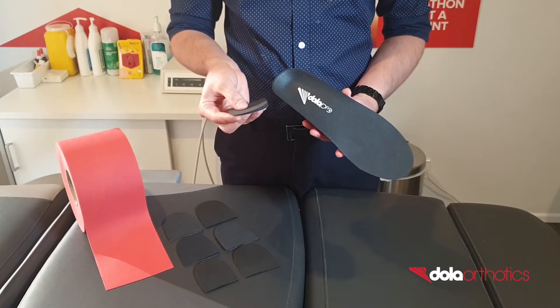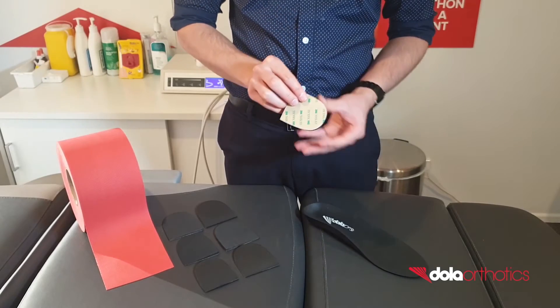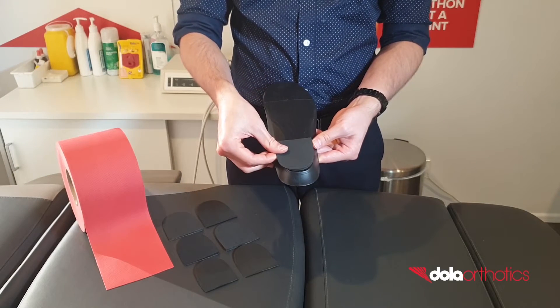Customisation of the Dola Pro with the addition of a rear foot valgus wedge. Place a self-adhesive EVA rear foot wedge on the plantar heel surface of the Dola Pro, ensuring the wedge is thicker on the lateral side compared to the medial side.